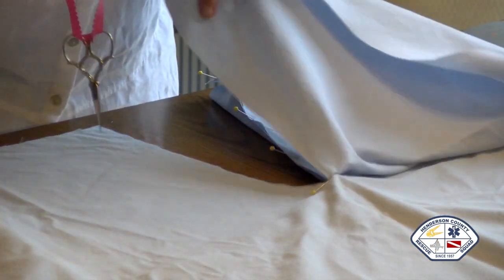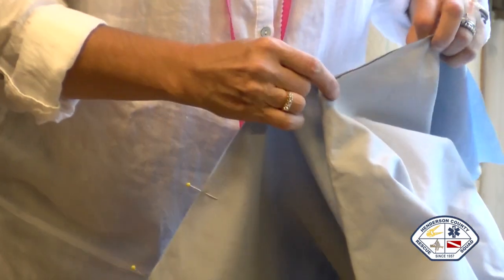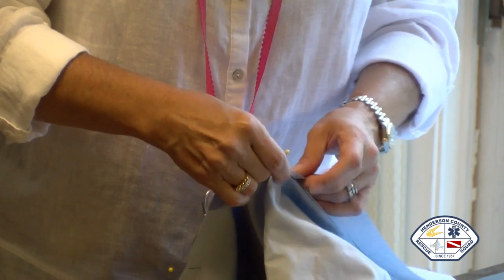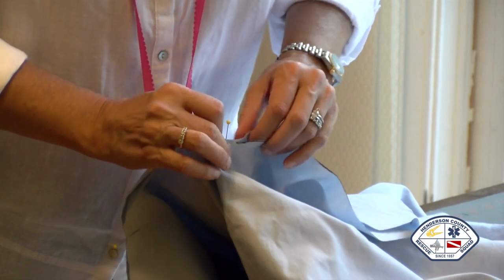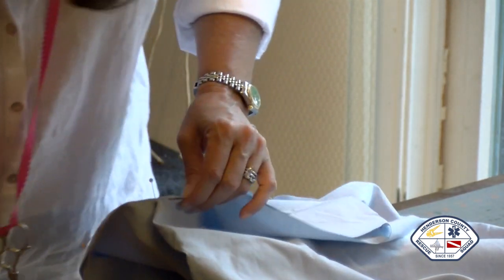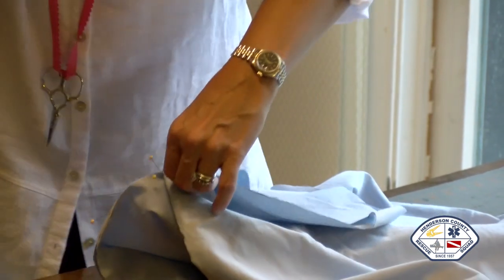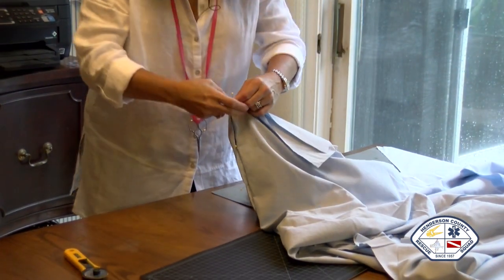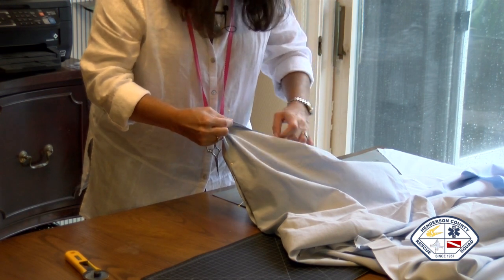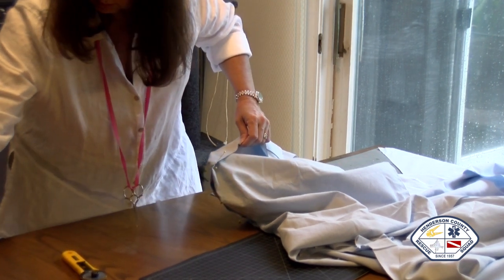Now, in order to get it on the other side, we have to kind of fold it over and pin this way. In the drawing, you'll see that it looks kind of weird. And I had to look at it a couple of times to figure out what in the heck they were doing, because this goes against the way most people sew. This is going to have a seam along the top. Most people have a seam in the underarm. This one's going along the top, so don't try to put it in backwards, or it will make sewing the last final stage a whole lot harder.